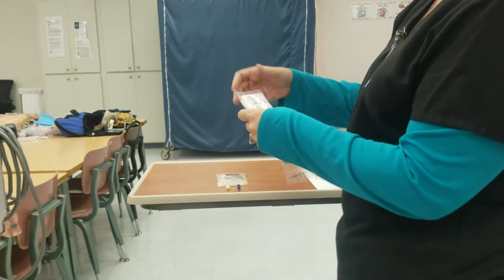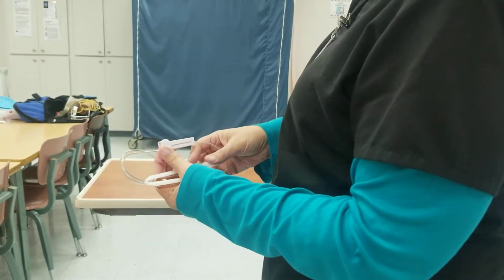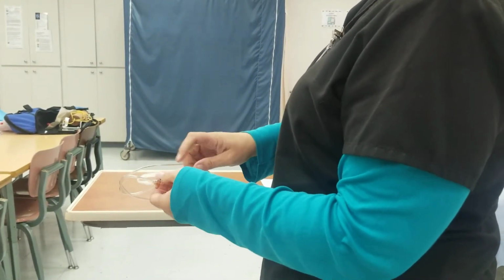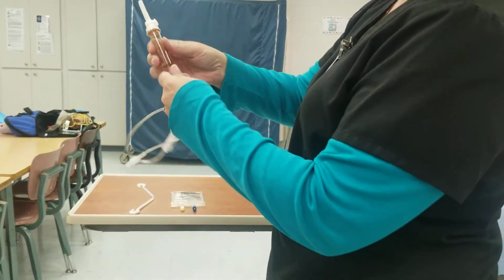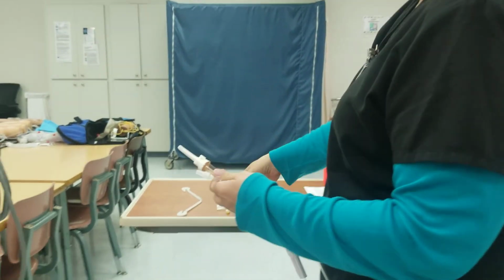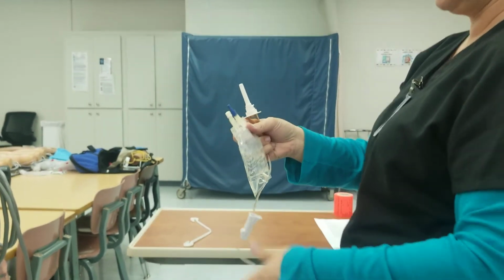Here's our secondary tubing. Open it up, got the perforation up there. Remember, the first thing that we're going to do is we're going to close that clamp. This right here is your little extension. I'll show you what to do with that. So it's just a shorter tubing. This is your secondary tubing. So you can either hold it, pop that blue cap off and insert it, or you can hang it up. It's whatever you're comfortable with.